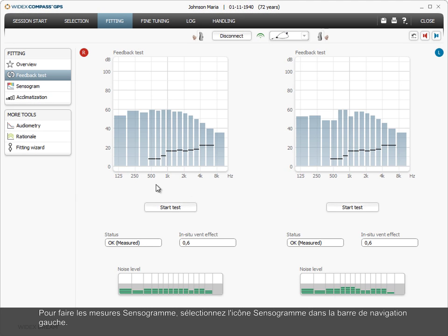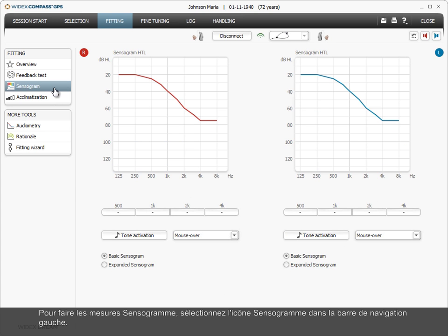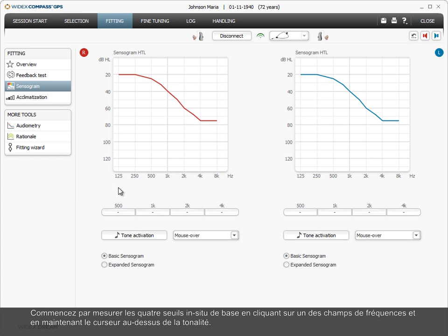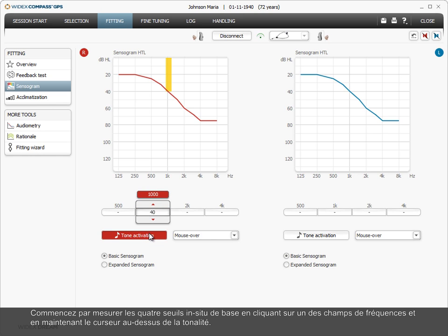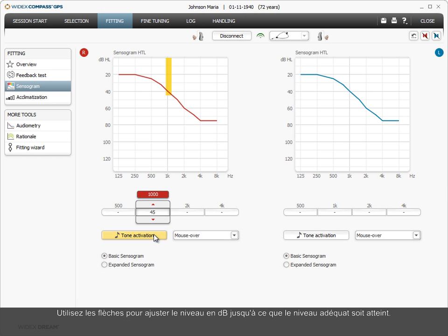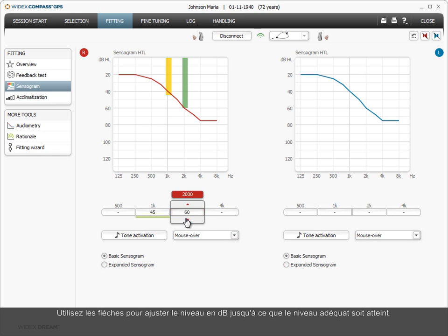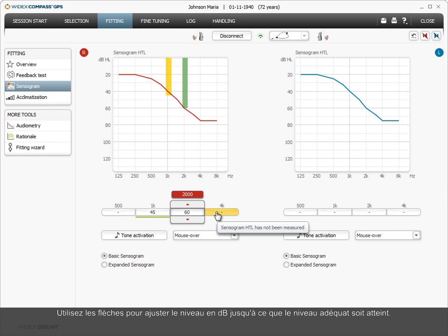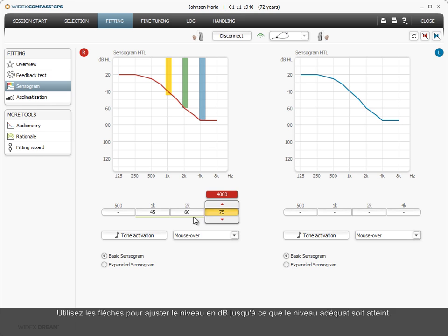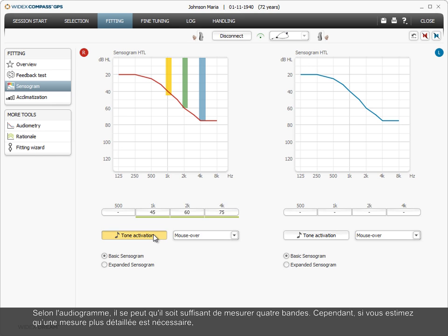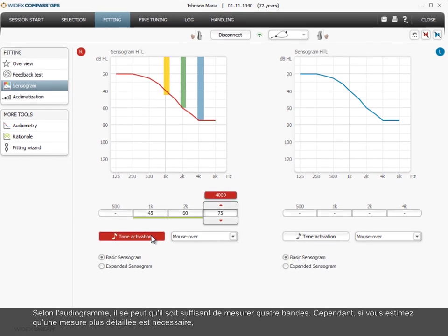To proceed to the sensorgram measurements, select the sensorgram icon in the left navigation bar. Start to measure the four basic in-situ thresholds by clicking one of the frequency fields and holding the cursor over the tone. Use the arrows to adjust the dB level until an adequate level is reached.